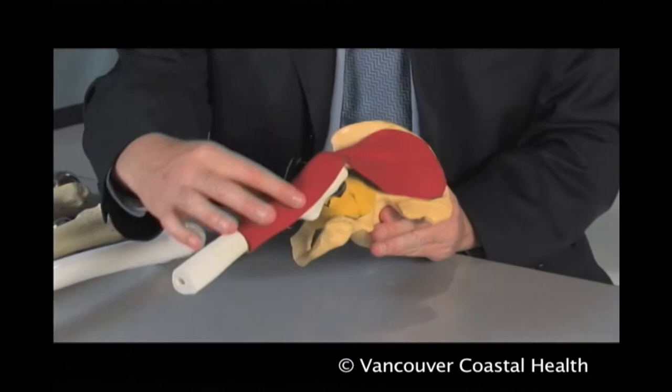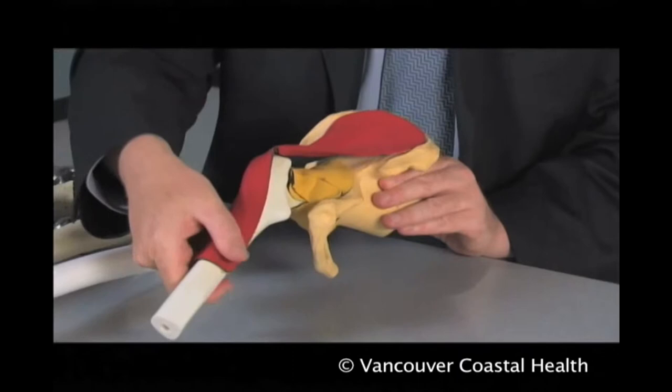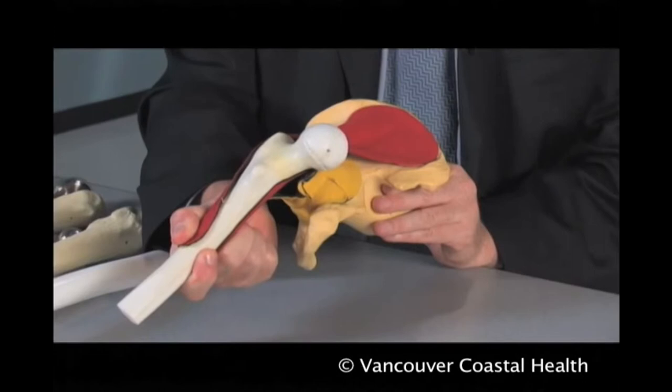When we do surgery on the hip joint, the two most common surgical approaches involve placing the patient on their side. The gluteus medius — the main abductor — is exposed here in the red. We can reflect that muscle posteriorly to see the capsule, incise the capsule, and then bring the hip out anteriorly in order to do the operation.